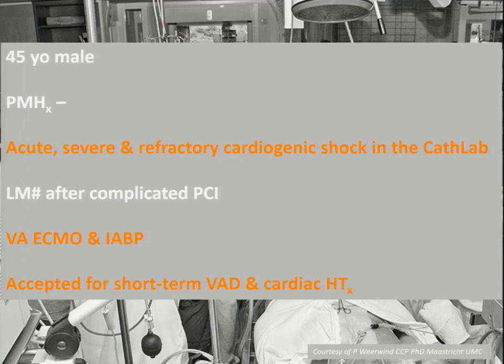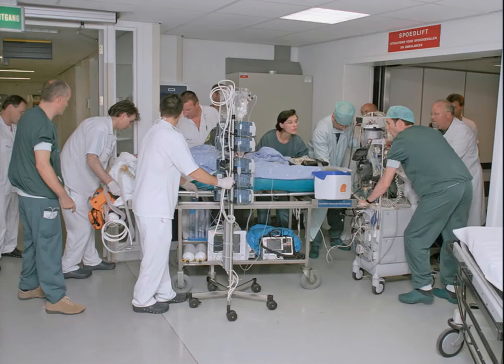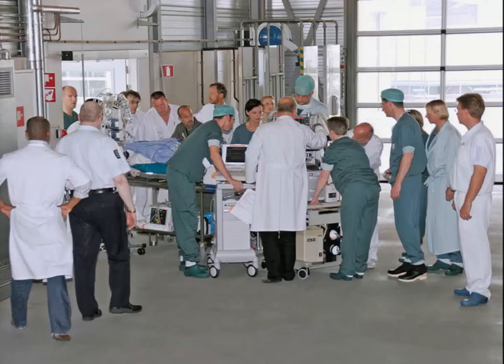So he was accepted in Leuven at that time, as there was a good relation with the hospital in Leuven, for short-term support and ultimately cardiac transplant. More than 10 years ago, it was not trivial to transport a patient on ECMO. So what you see here is all efforts were taken to put the patient on transport. The first obstacle is the lift, as you can see here, the balloon pump, monitoring. So everything is improvised at that time.